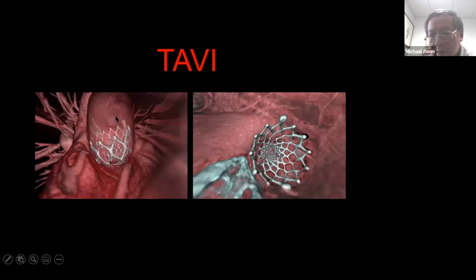It can cause the aorta to balloon, to dilate, become an aneurysm. And the one way to fix it is to put in this type of stent graft. So it basically is a scaffolding that you put through either the arm or the leg, and then you expand it and literally crack open the old valve, and inside this scaffolding, there is an artificial valve that you put in. So now you can replace an old stenotic valve with a brand new prosthetic valve using this scaffolding with the valve in the center.